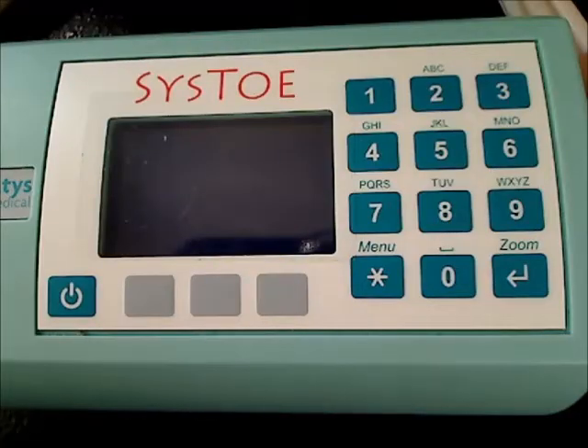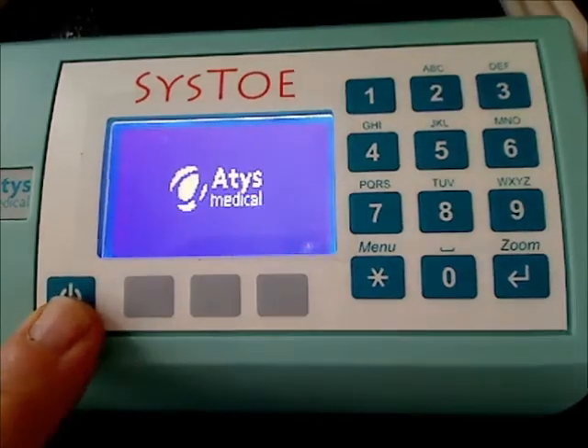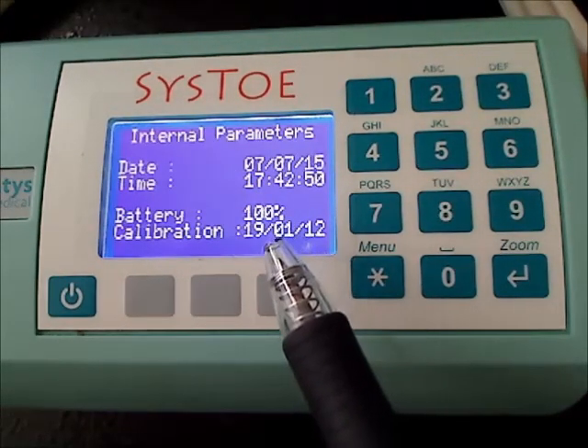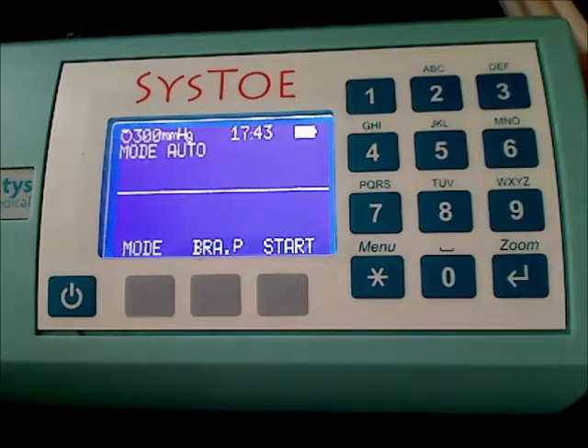To switch on the SysToe, click on this key. A message is displayed giving information on the charge of the battery — here, 100%. Charge the battery only when it is flat. If the battery is charged more than necessary, it will be damaged.